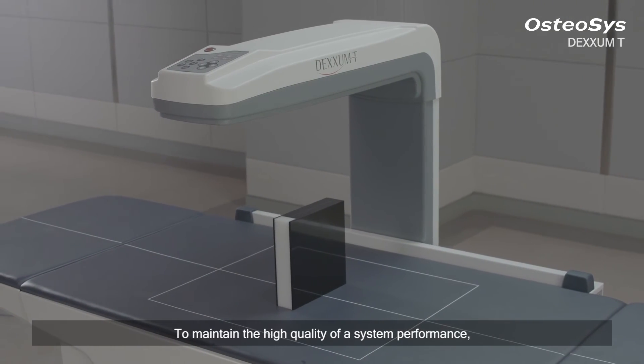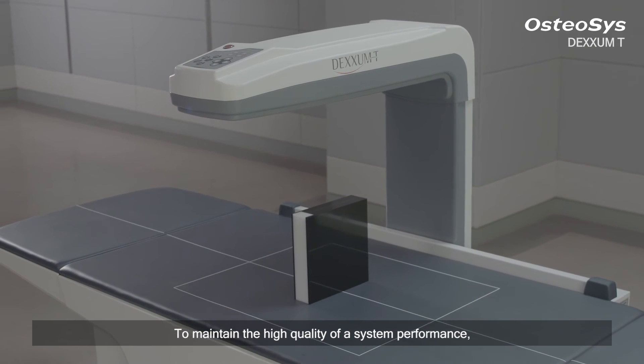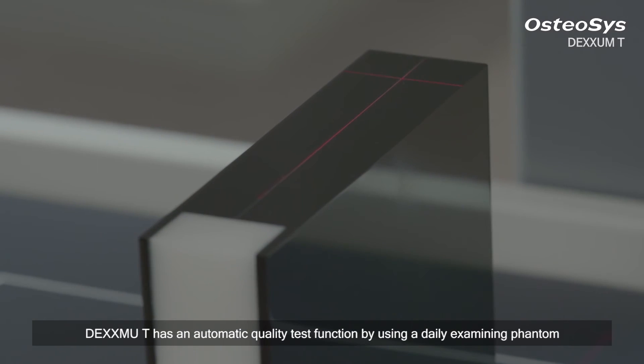To maintain the high quality of system performance, DEXXUM T has an automatic quality test function by using a daily examining phantom.